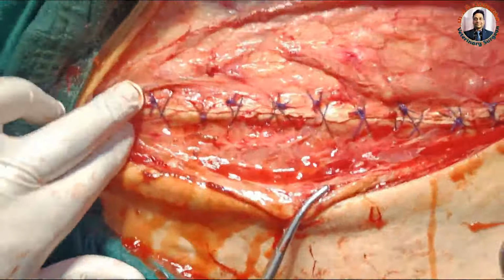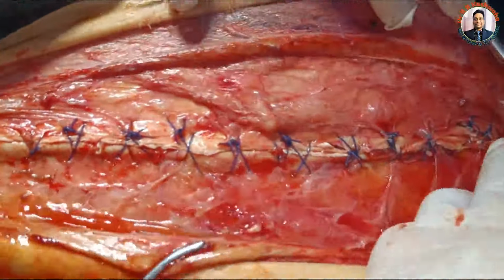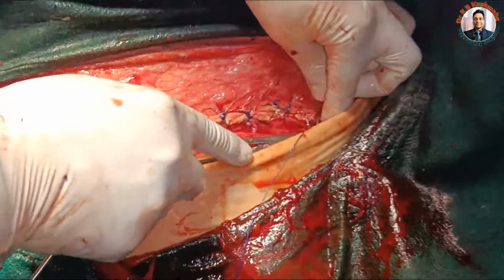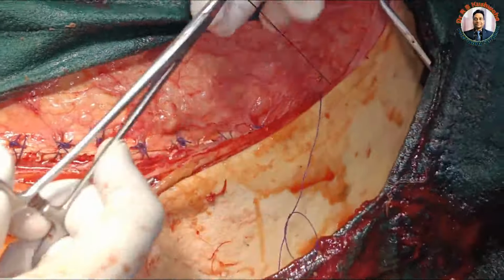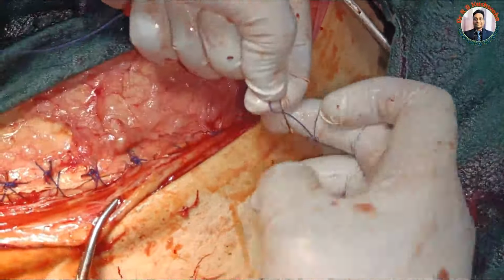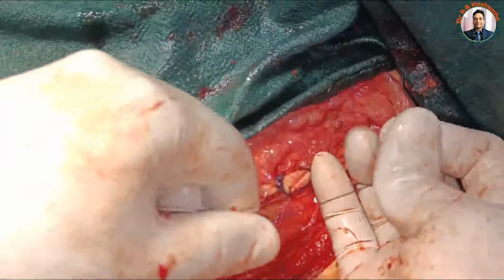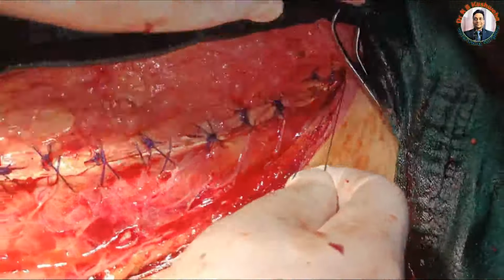So here you could see we have repaired this laparotomy incision by applying this number 1 polyglactin 910 and cross mattress. Here the rectus abdominis has been repaired, but this aponeurotic part has been left a bit. So just apply one here, simple interrupted. So in this way we have completed the closure of the laparotomy.